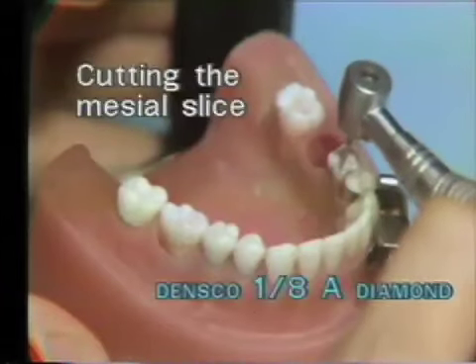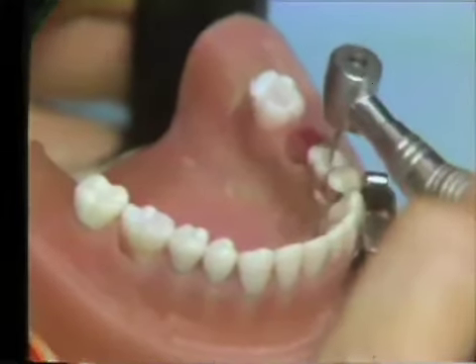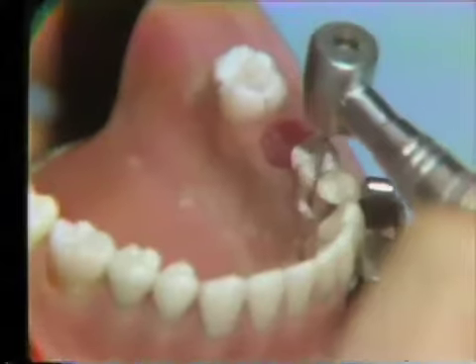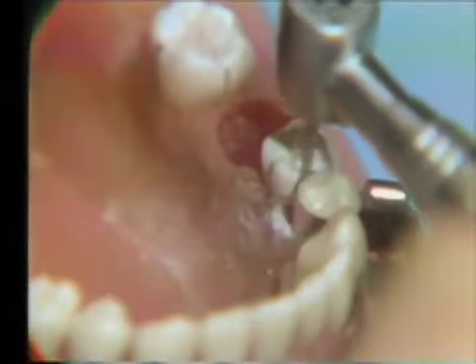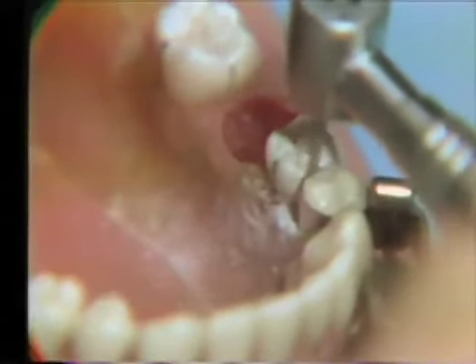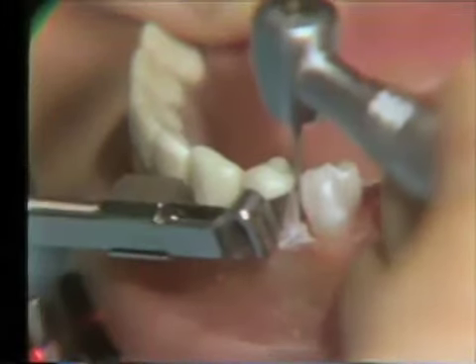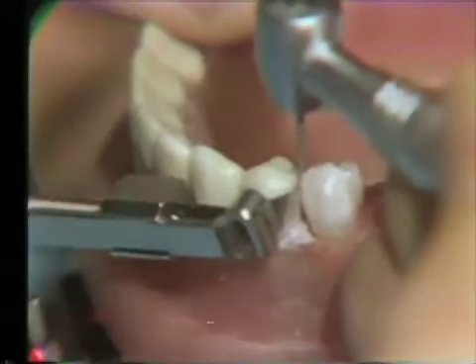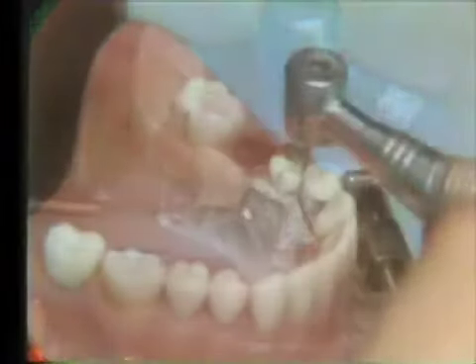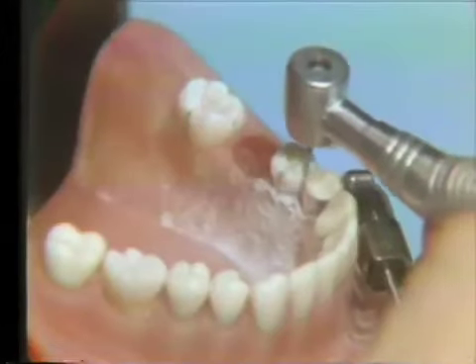A Densko one-eighth diamond is used to make the mesial slice. This is started from the lingual, making sure that you do not cut the adjacent tooth. A buccal access is also carried out, taking care that this margin is not carried too far to the buccal surface to have an excess display of metal. When the slice is completed, you should freely be able to move the diamond through this area.